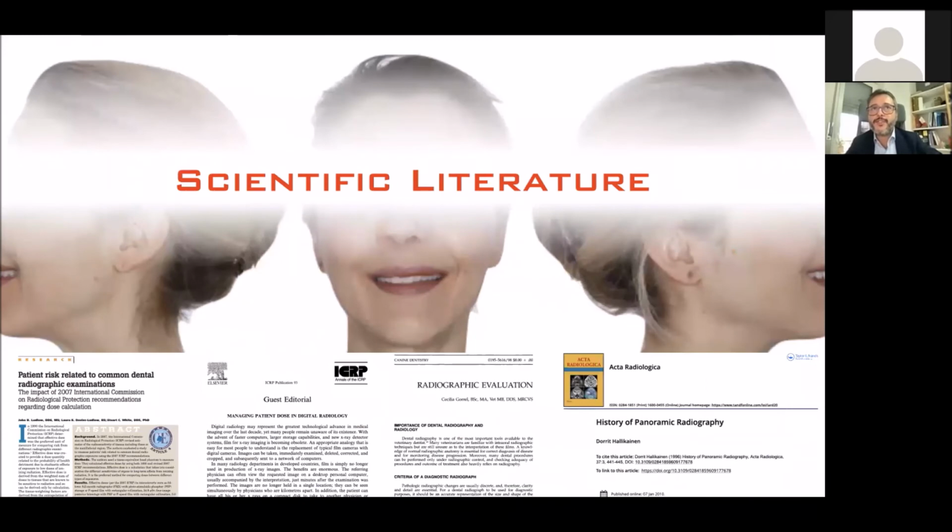For its operational and technological characteristics, digital radiology has several advantages. It allows to reduce the dose of exposure to the patient by 50% without sacrificing the diagnostic quality of the image. It allows to avoid overexposures as any errors are immediately detected. In the latter case, with the traditional system, there is an excessive blackening of the film and a consequent loss of clinical information.